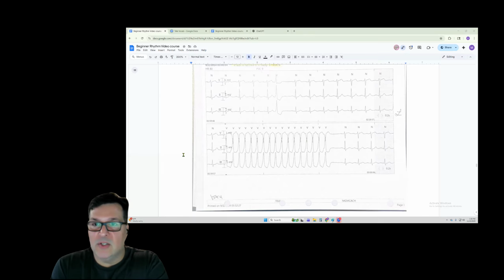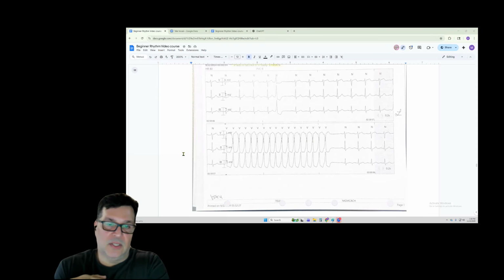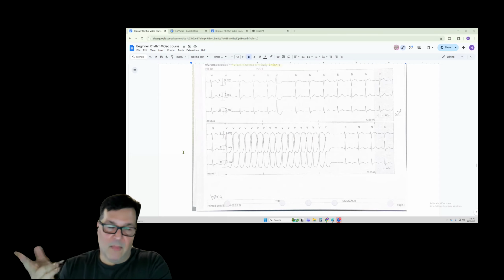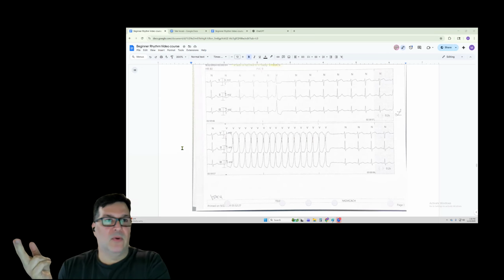Where Kristen works right now, there's an automatically generated alarm that will go out to their communication device called the Vocera. These alarms, where I'm currently working, will go to the phone. Emily will have to speak on how she receives those alarms. How well does that work for you, Emily?